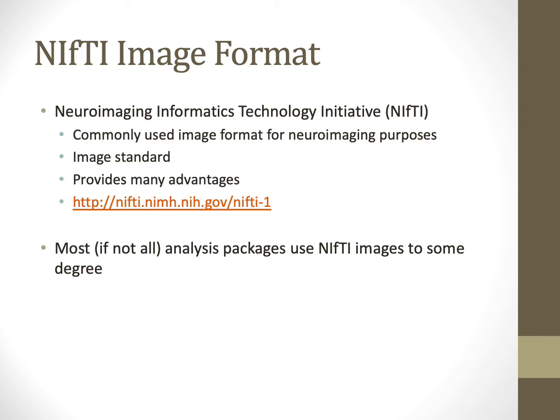The NIFTI image format, or the Neuroimaging Informatics Technology Initiative, is another standardized image format that is commonly used by different neuroimaging softwares and packages. It provides many advantages and was developed at the NIH.